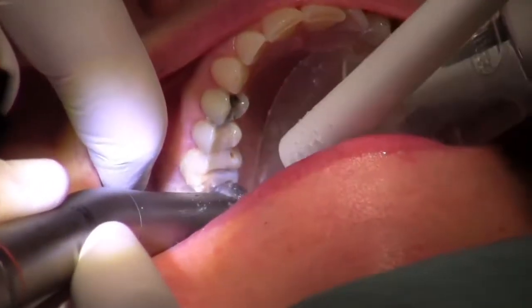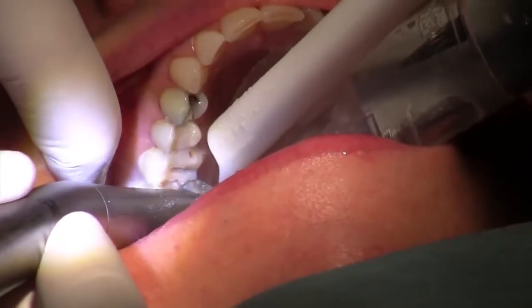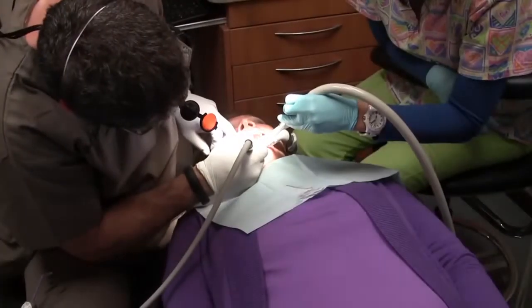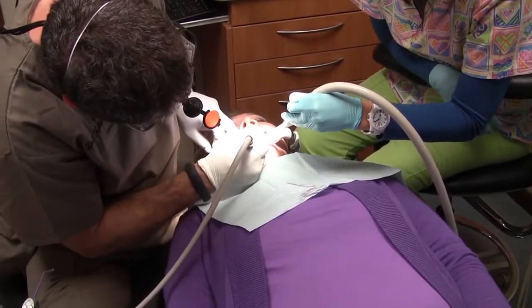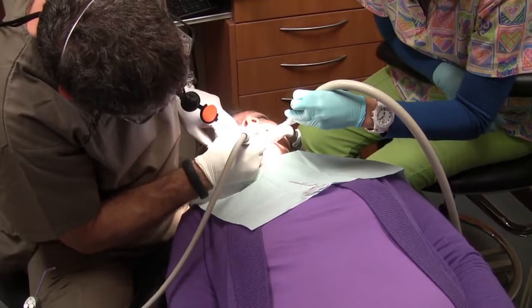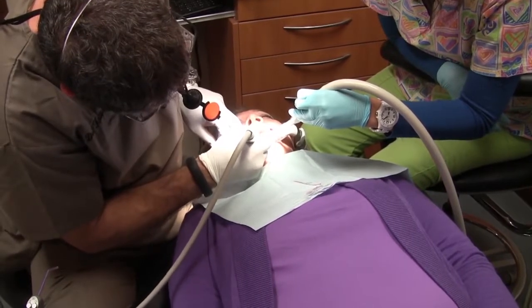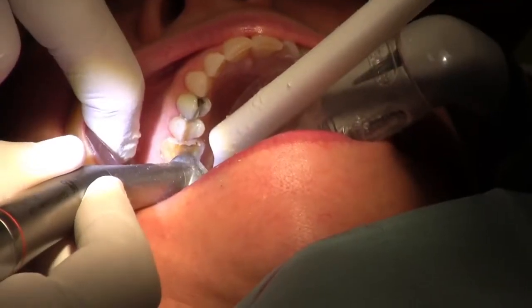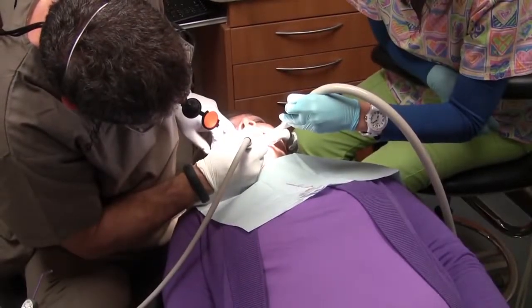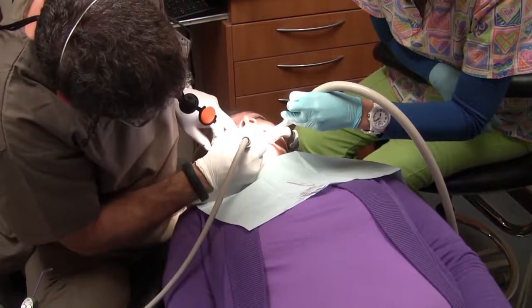We start this procedure by giving local anesthesia to completely numb the area. The tooth is then reduced systematically so that a crown can be placed upon it. It is a very structured preparation and usually does not take much time. We then make sure that there are no old fillings in the tooth, and if there are, the fillings are removed and decay is taken out of the tooth.